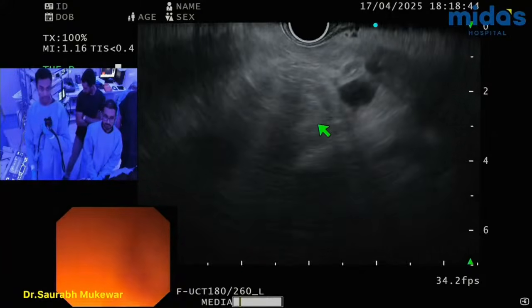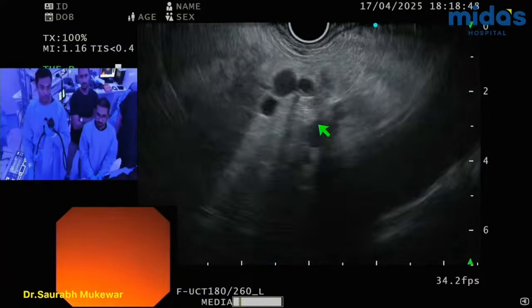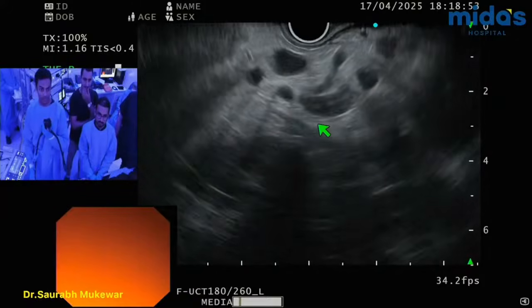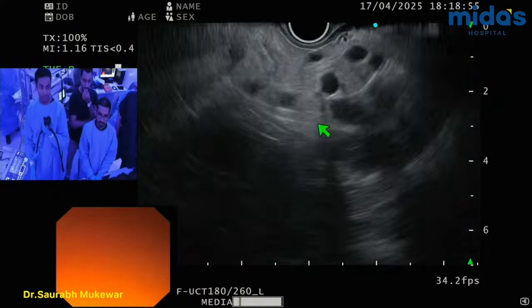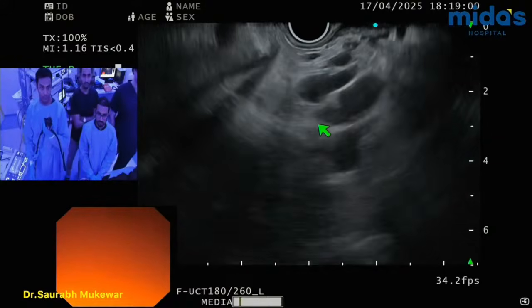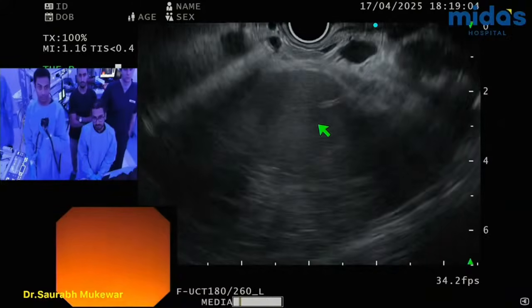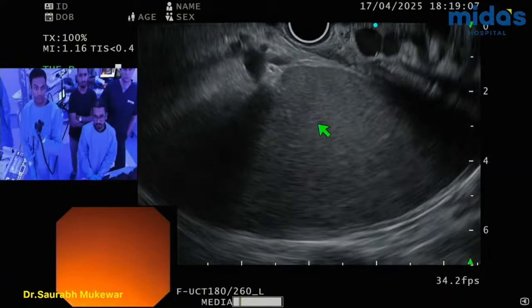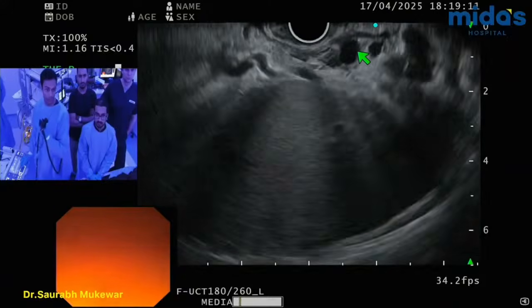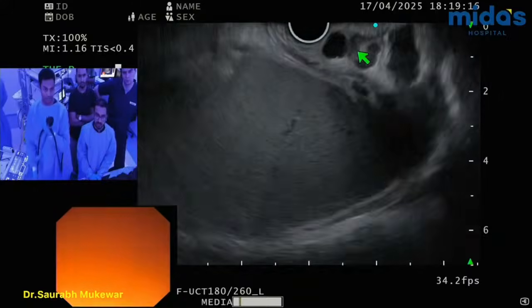You can trace it coming here, going here, and then you can do the reverse tracing, going up. It goes up, and there you go, it's penetrating. So now we've traced it both ways, from the portal vein and from the varix itself. Okay, let's do it.